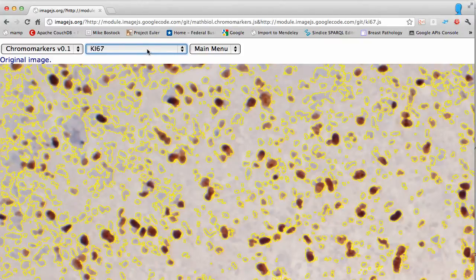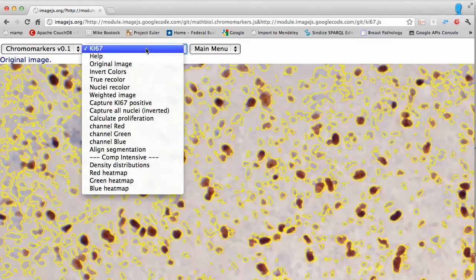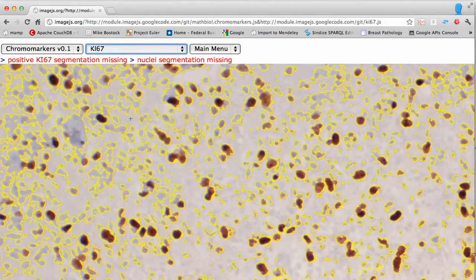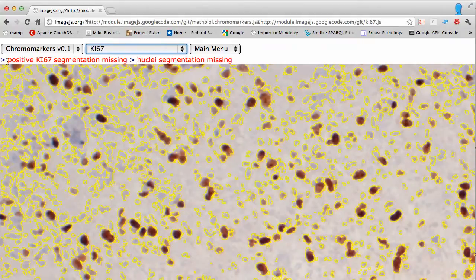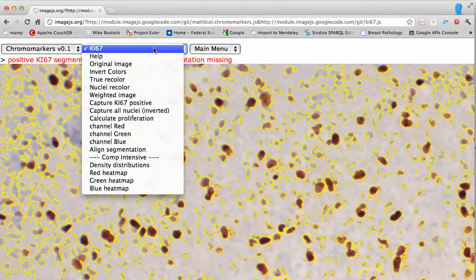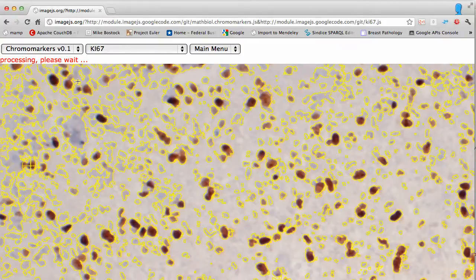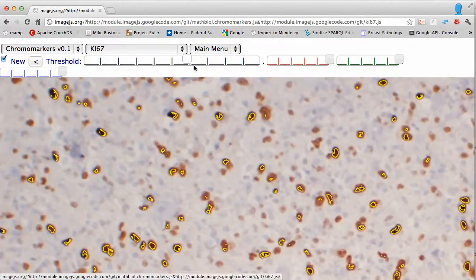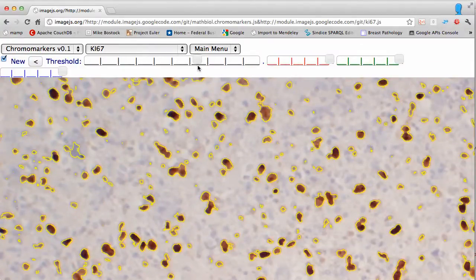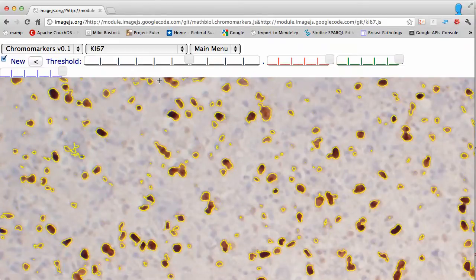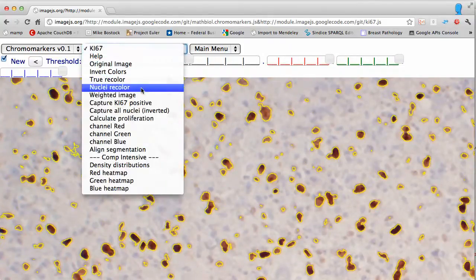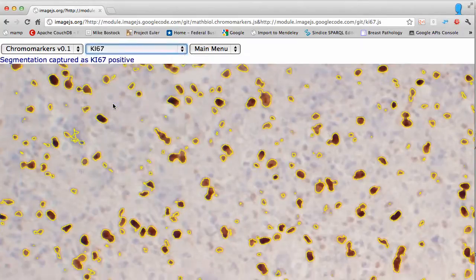Once you are happy with the segmentation and try to calculate proliferation without capturing the segmentations, you get an error message saying you have neither segmented out the nuclei segmentation nor the ki67 segmentation. So capture the all-nuclei segmentation you've done, then move to the ki67 region by picking one of the brown spots. Using chromo markers again, adjust the threshold to capture all the corresponding features, then capture ki67.